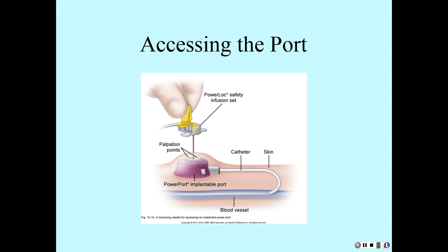Once you do that, you take this down, and it has a tube, and it connects to your IV fluids or whatever it is. If you need to draw blood, you can draw blood. But if you can, keep the needle in while you're doing your IV therapy. You just tape it down and secure it.